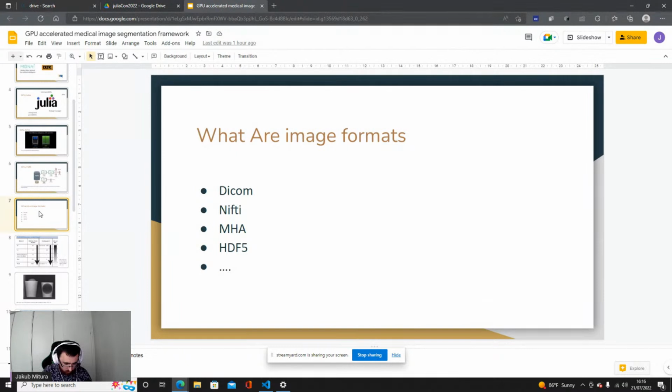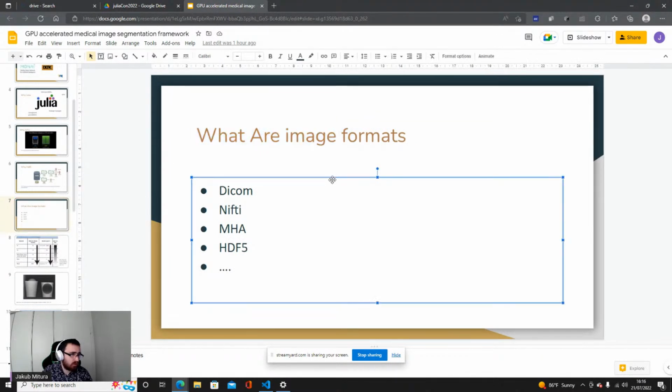First of all, as you have heard, I suppose, many times, in order to do anything in data science, you need to understand your data and what this data represents. Medical data has a lot of variability and a lot of formats it can be saved in.